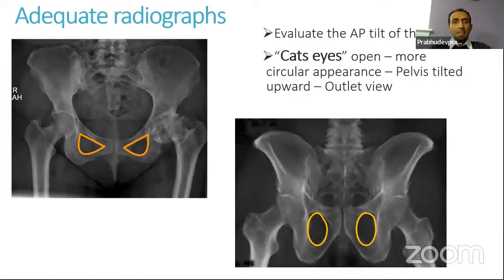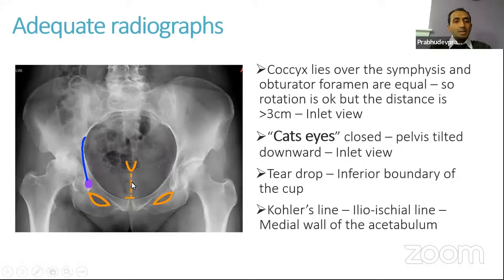In an inlet type of view, the coccyx is quite far away from the symphysis pubis and the obturator foramen are almost completely closed. Again, we don't want to be templating on these types of X-rays. We need to identify certain important landmarks.